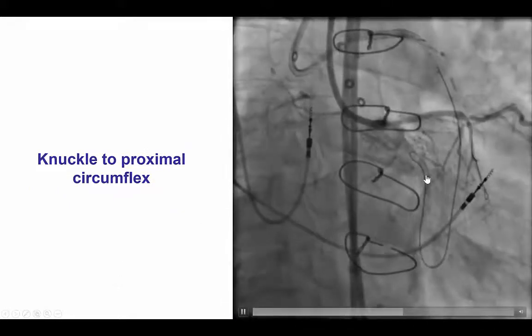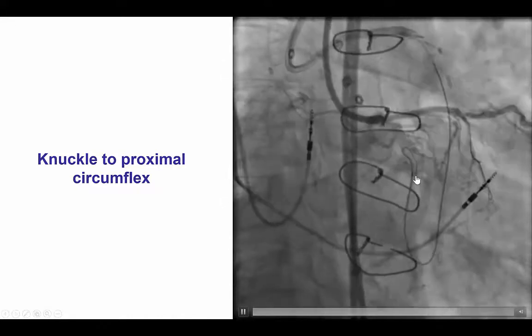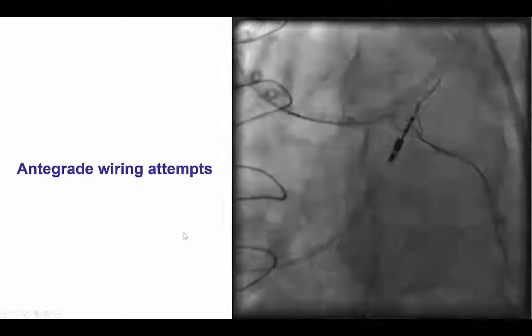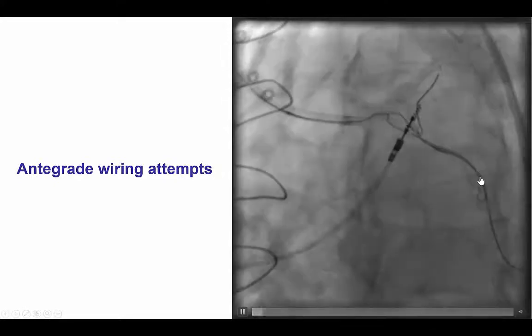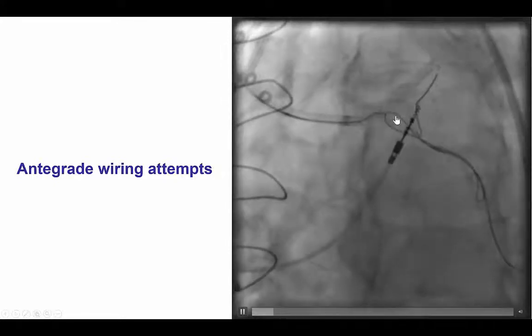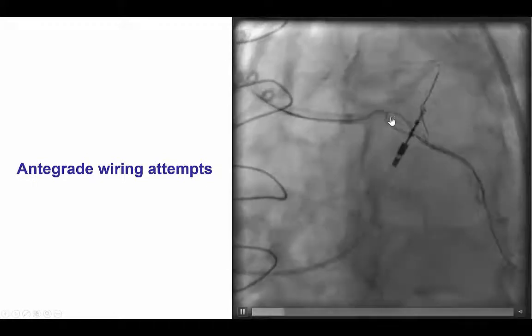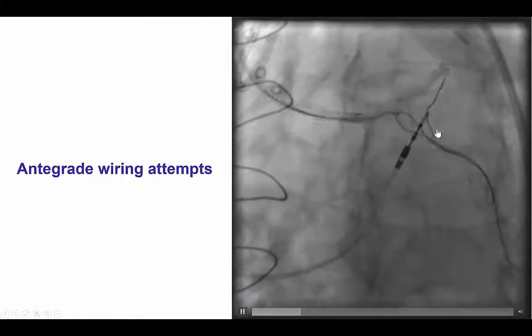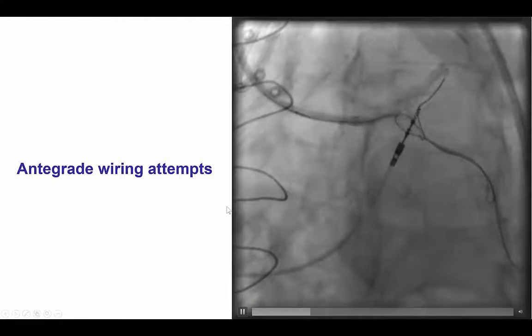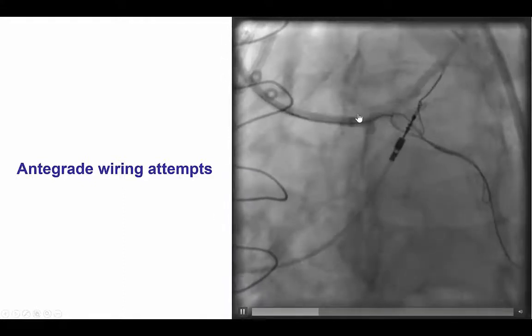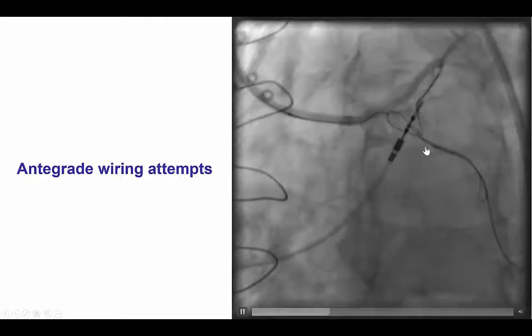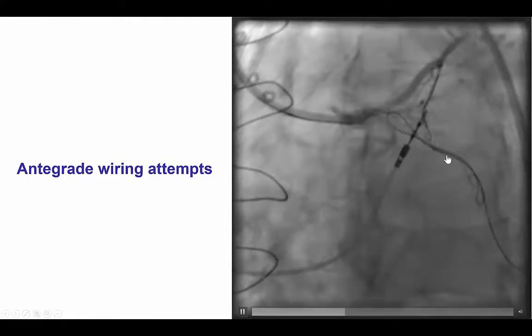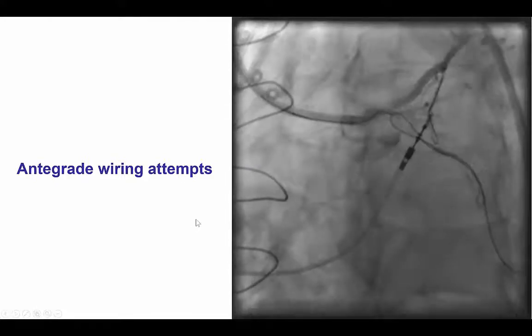We then changed to a knuckle wire given the ambiguity distally, and were able to advance the knuckle wire retrograde into the mid-circumflex. We then advanced the retrograde knuckle wire all the way to the ostium of the circumflex and the native left main. We did multiple antegrade wiring attempts trying to advance a guidewire to the mid-circumflex and then potentially perform reverse CART. However, we were unable to advance an antegrade guidewire into the circumflex.